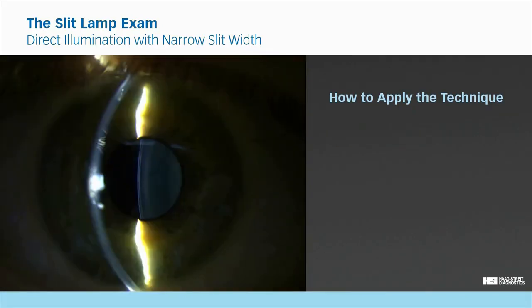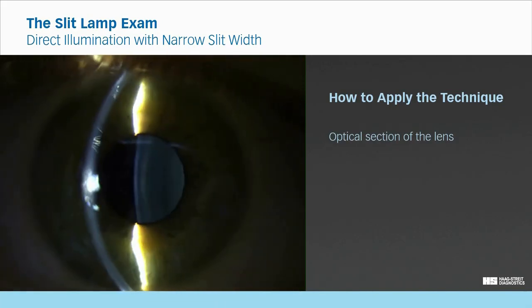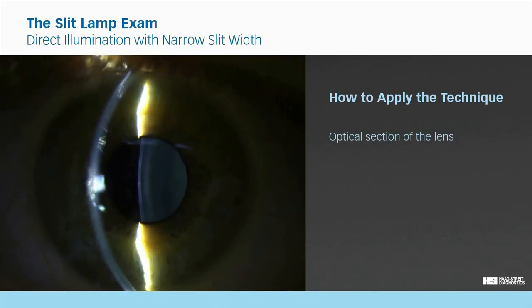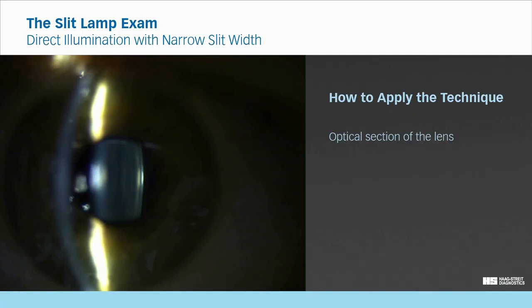Using the optical section for the examination of the lens is relatively simple when you use the capsular bag as landmark. When you have the cornea in focus, just move the slit lamp in until your focus is on the anterior capsule of the lens. You will need to reduce the illumination angle for reaching the posterior capsule.